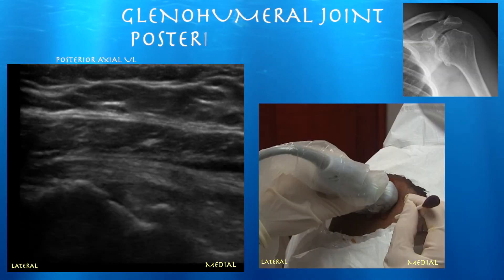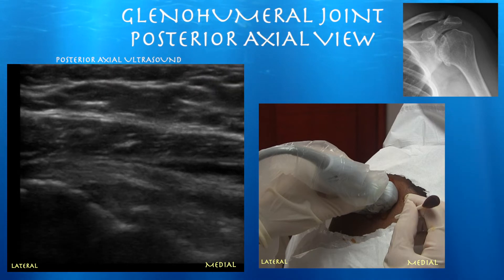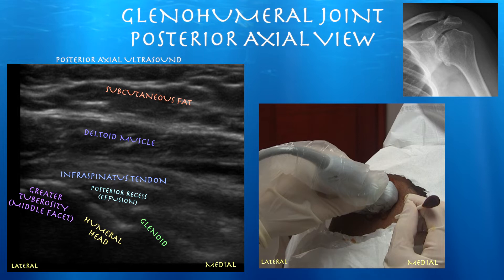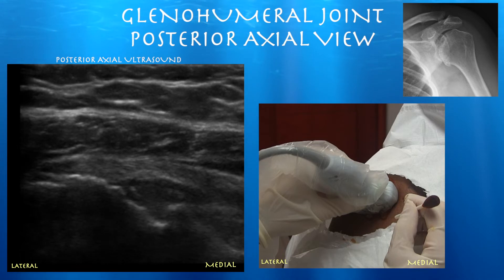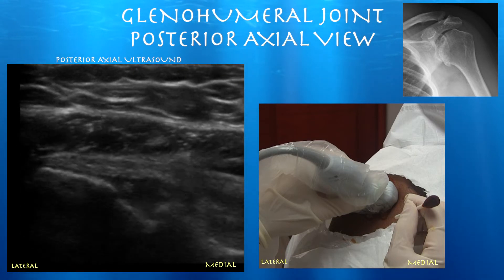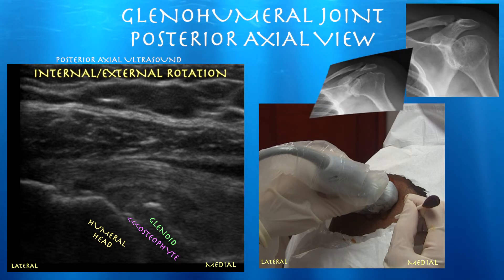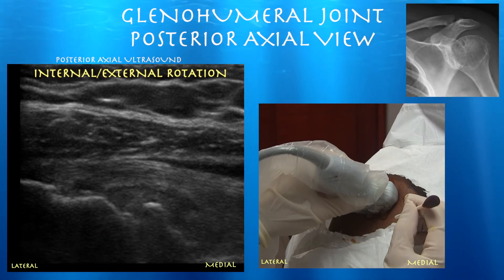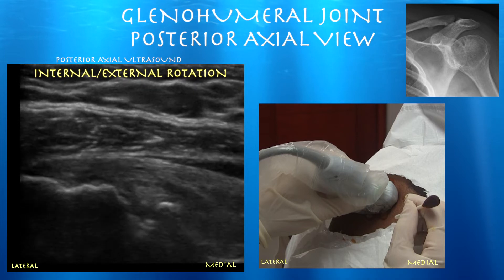The whole work of this procedure is essentially done before the injection — you want to anticipate where the needle is going to go. You have to identify the humeral head, the glenoid, the infraspinatus tendon, and deltoid muscle. You essentially want to aim right between the glenoid and the humeral head, which is where the joint space lies. Sometimes you can mistake the greater tuberosity for the humeral head, so internally and externally rotate the arm to see the articulation of the humeral head with the glenoid.